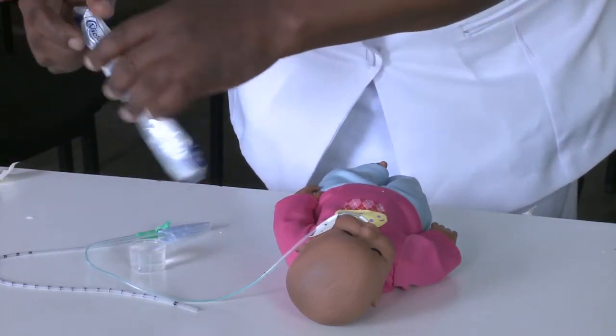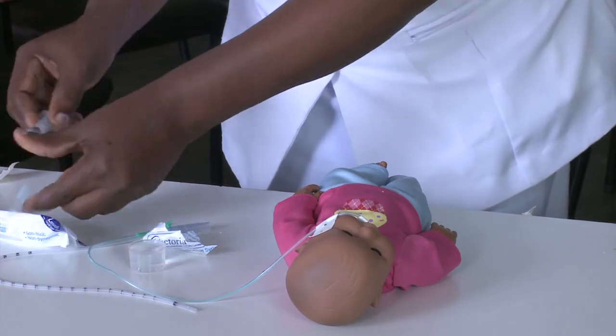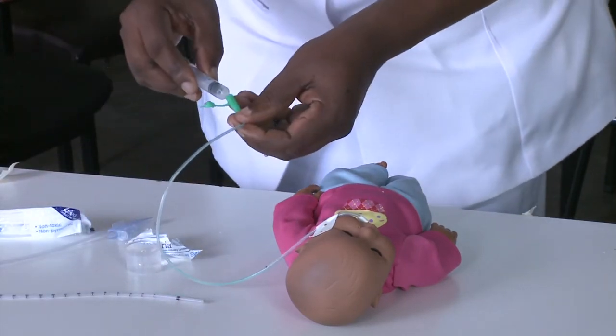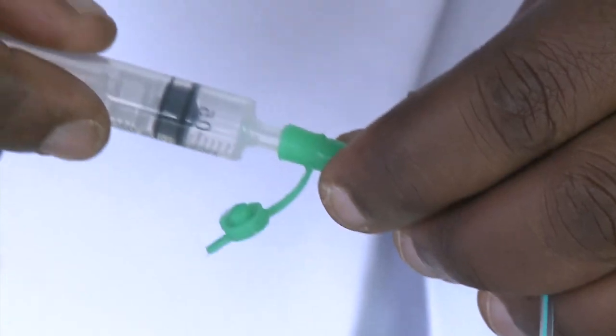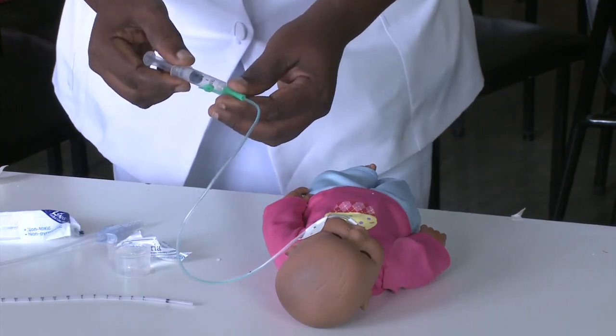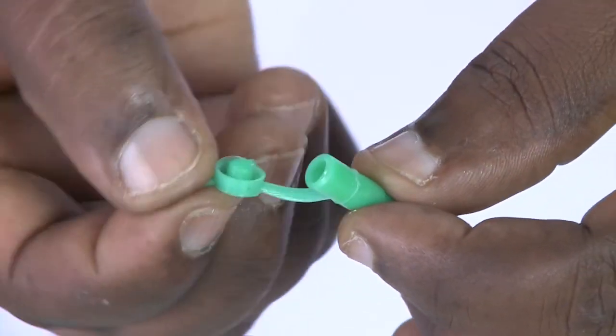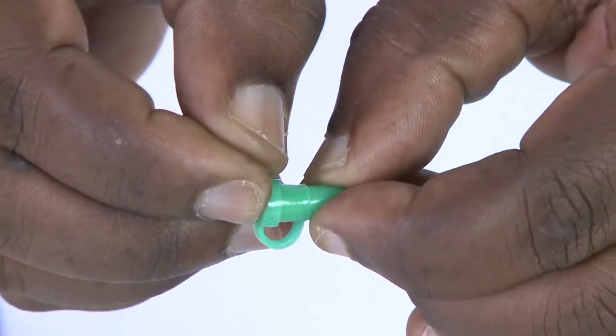There's another way of testing. If you don't want to use the water, we test with the syringe. I'll try to aspirate to make sure the tube is in the stomach. There are abdominal contents coming, therefore my tube is right in the stomach. Then I'll close the end of the tube.